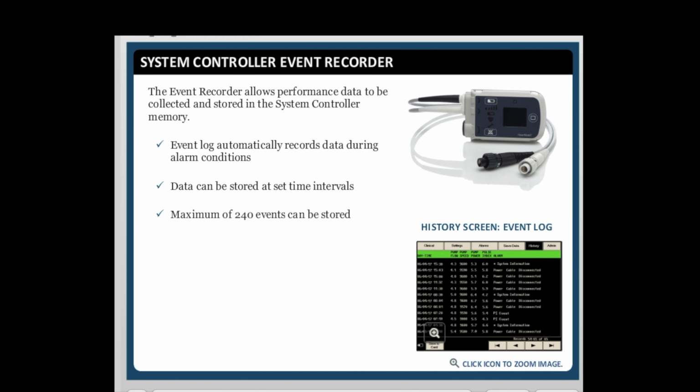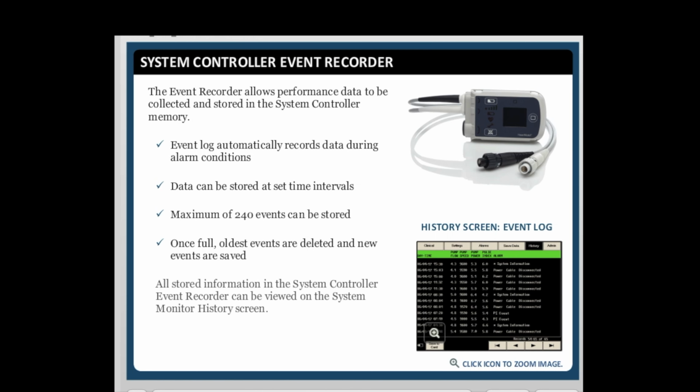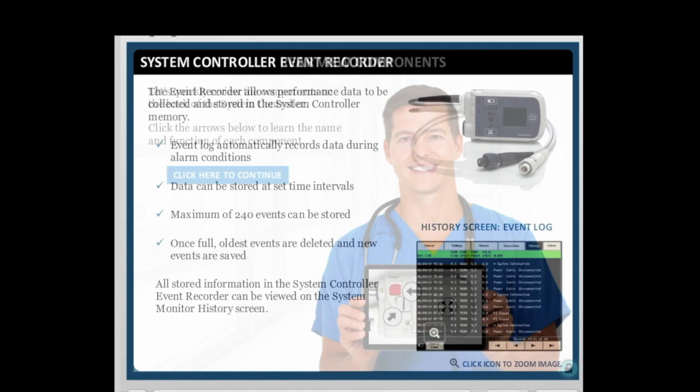The event recorder can store up to 240 events, which includes both alarm events and data captured at set time intervals. Once the event recorder is full, the oldest event is deleted and the newest one saved. All stored information in the system controller event recorder can be viewed on the system monitor history screen.